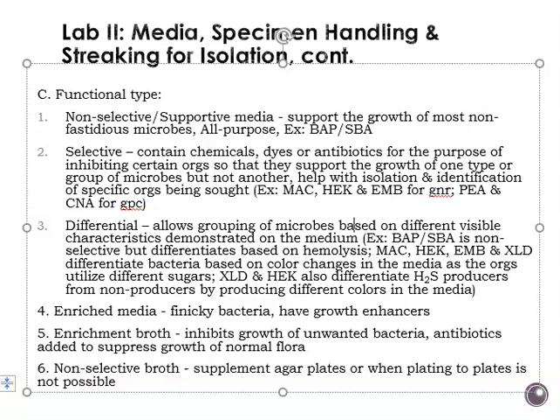to our agar plates. So your non-selective broth media is able to detect small numbers of most bacteria, but again, it would have to be subcultured to solid media in order to test and identify organisms. So an example of this type of media would be thioglycolate broth.